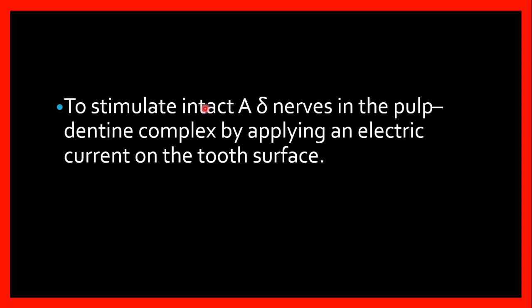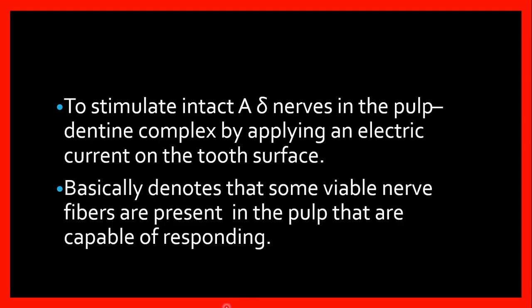So they stimulate the intact A delta nerve fibers in the pulp dentin complex by applying an electric current on the tooth surface, and they denote that some viable nerve fibers are present in the pulp and these are capable of responding.